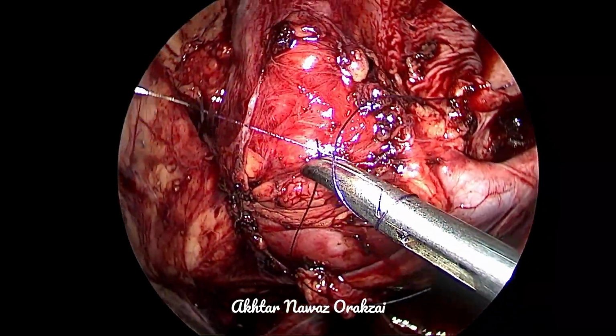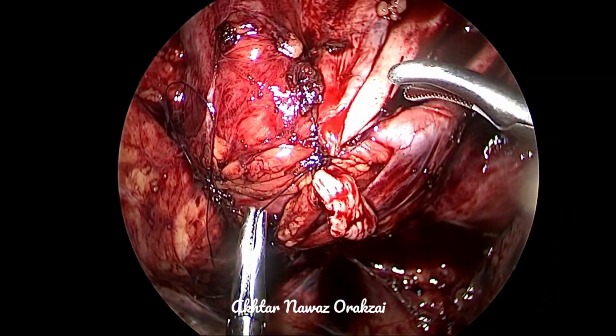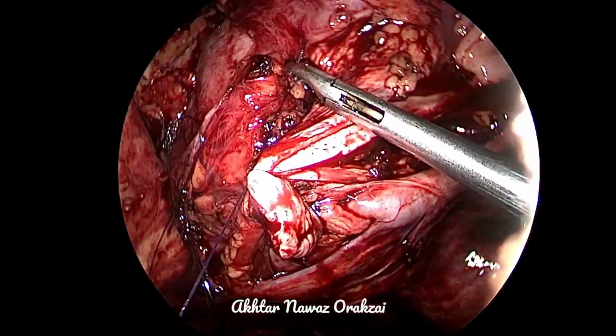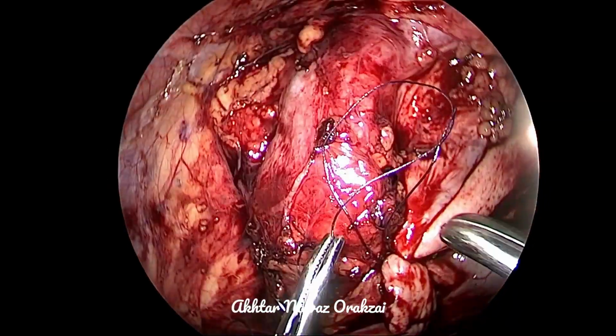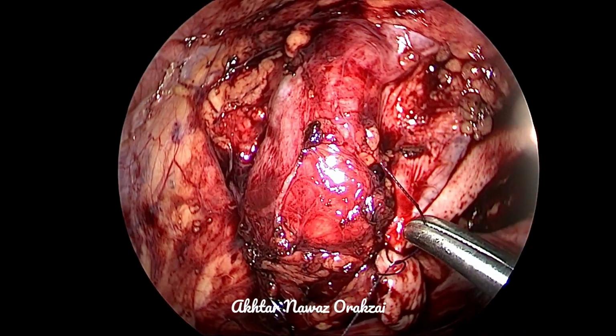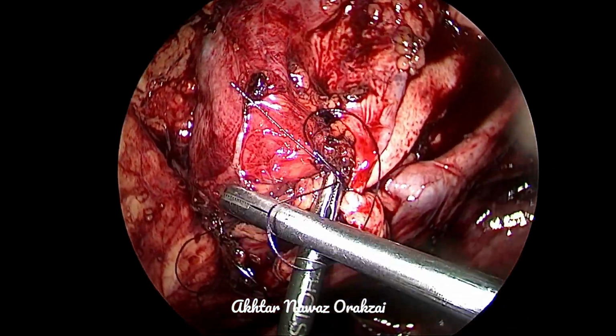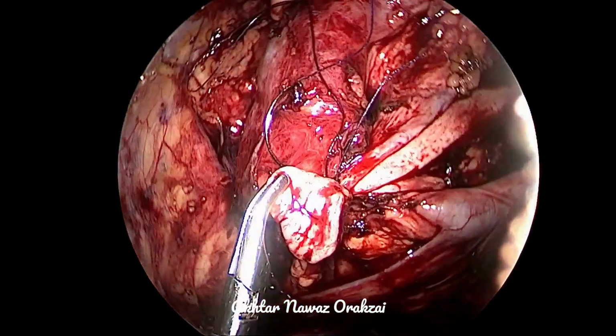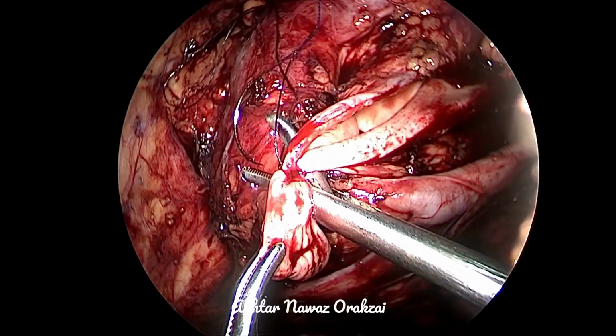And then we apply a surgical knot, and we can see that the ureter has joined the pelvis without any tension, and there is redness on the edge of the ureter, which is also quite satisfying.